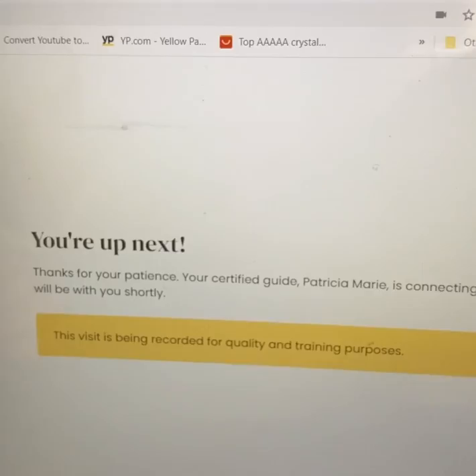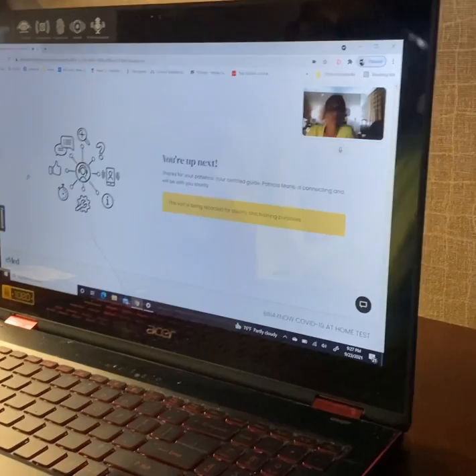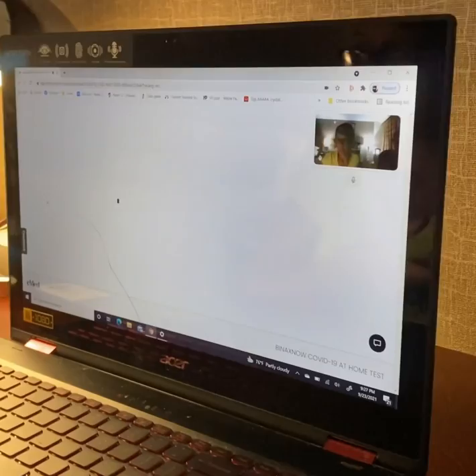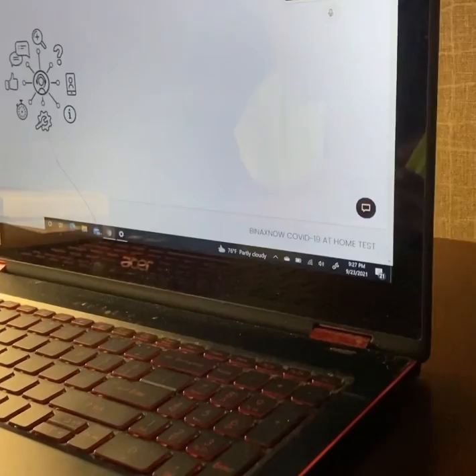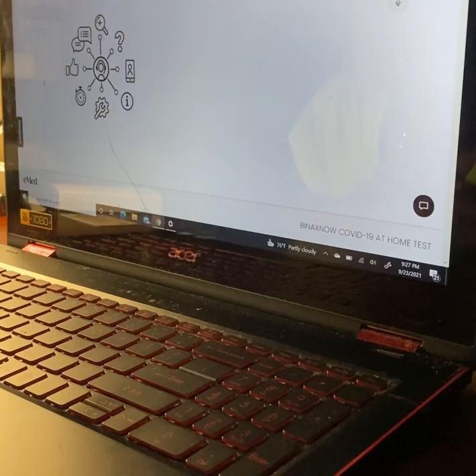Alright. Don't film me sticking a Q-tip up my nose. Hello, can you hear me clearly? Yes. Alright, my name is Patricia. I'll be your certified guide. Together we will prepare an activator test kit. The name and date of birth of the person being tested. Wendy Self, 9-22-1966.